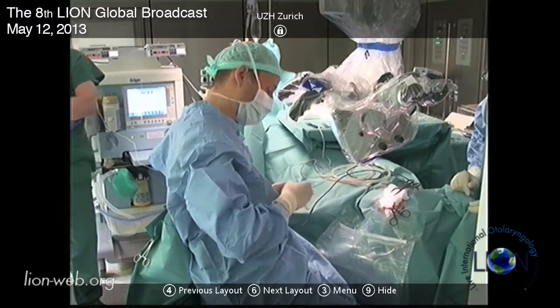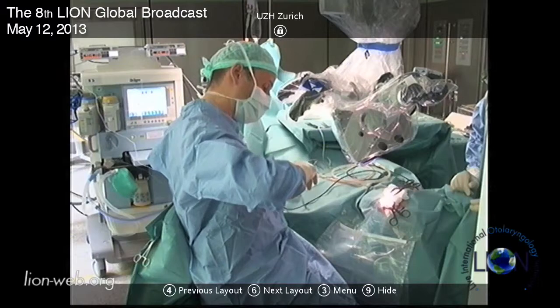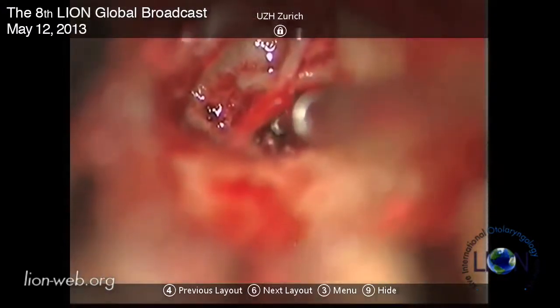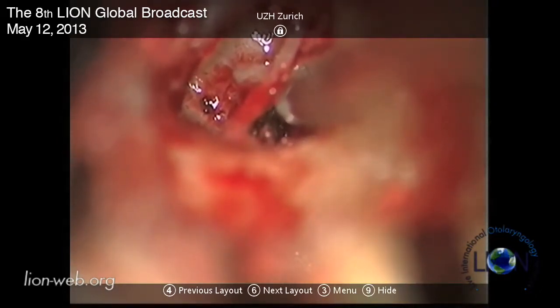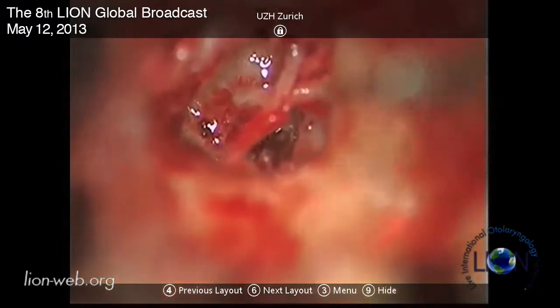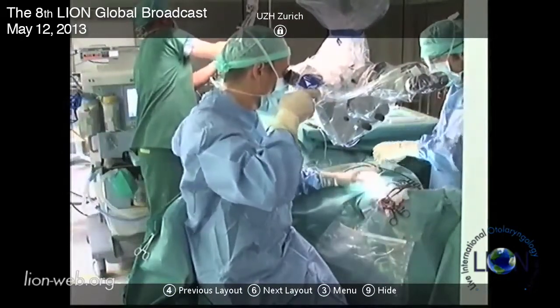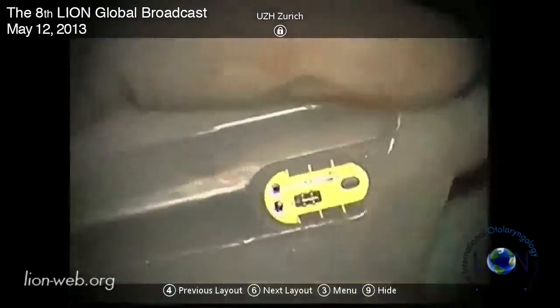Sometimes if you take it right out and put a little bit of fluid on it helps. Now it's good. So I make a little hole without any pressure, and that's it. The next step is I'd like to show you the prosthesis I use - the Nitibond prosthesis, which is this one here.